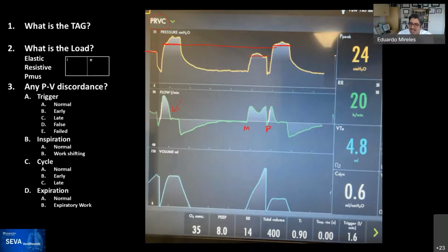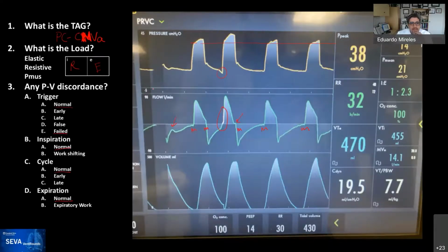Yes, I see it only on the Servo U. I have not seen other ventilators doing this, but that's correct. This is part of their algorithm, and I presume they have a set pressure that it calculates at some point for patient triggered breaths, and a pressure it uses for the mandatory breaths, or something along those lines, because it's not in the manual.